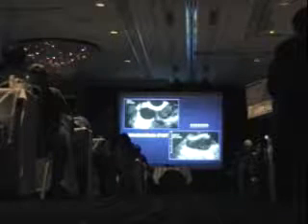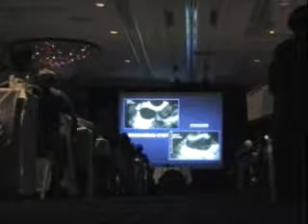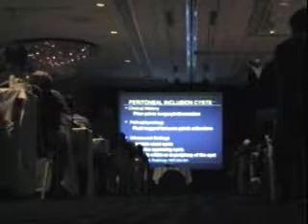Let's say in this patient, however, I'm starting to look, and now I see these, they look like septations. Well, is this para-ovarian? Is this something I should worry about? Is it ovarian? It turns out this is something called peritoneal inclusion cysts. And as we have better transducers today and do more and more imaging, particularly on ultrasound, we can see these fine septations that often, and sometimes even more than fine, they can be quite pronounced, in these things called peritoneal inclusion cysts. What are we talking about?